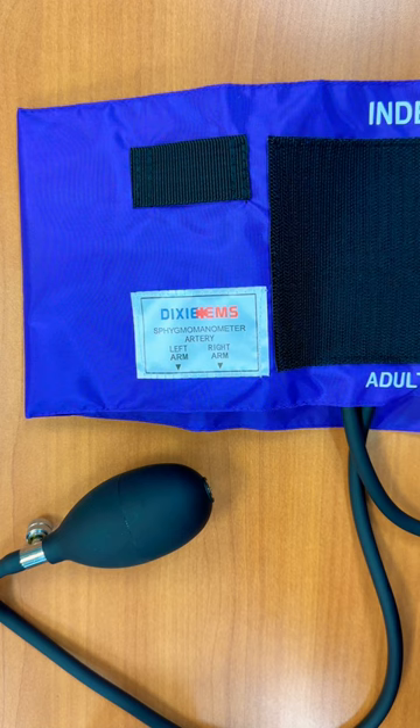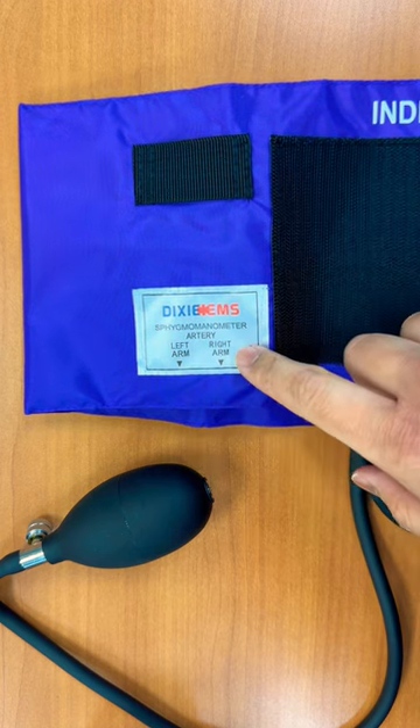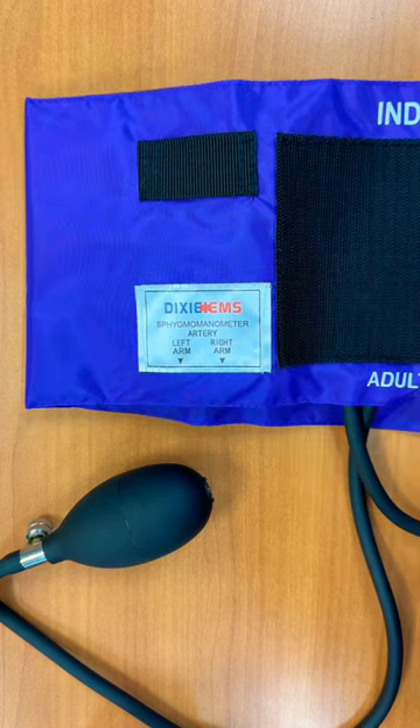This blood pressure cuff also has labels for left arm and right arm, that way you have proper placement on the patient.